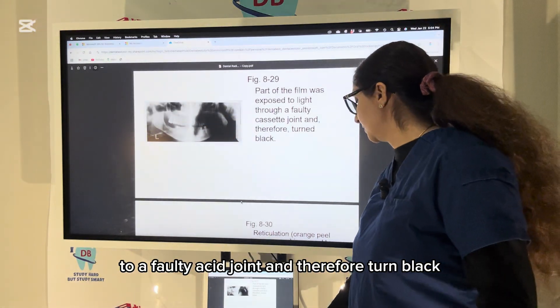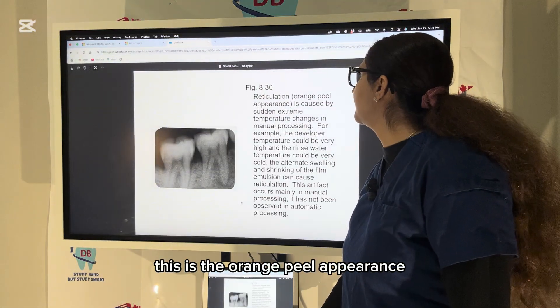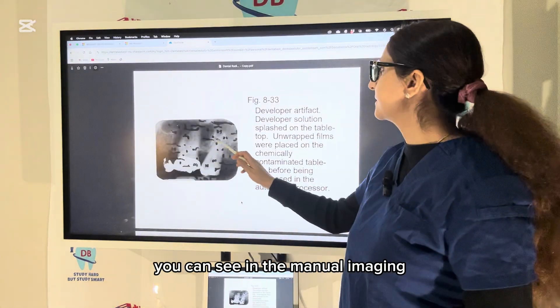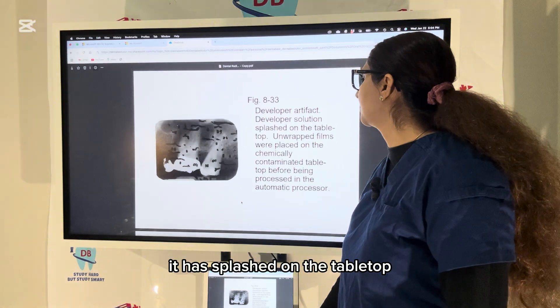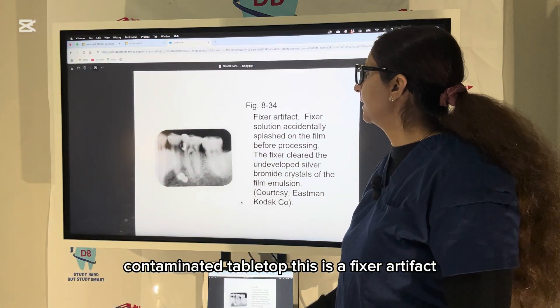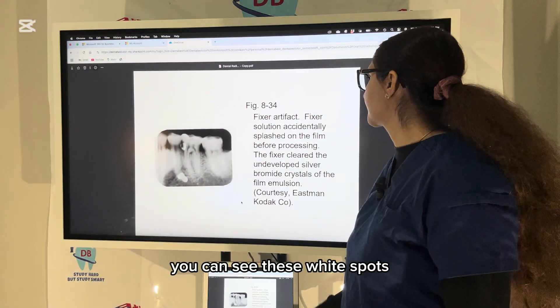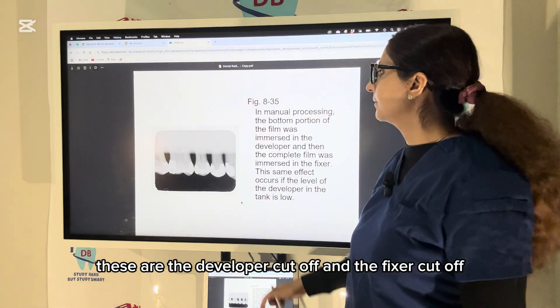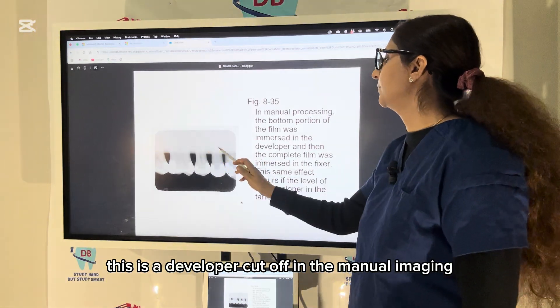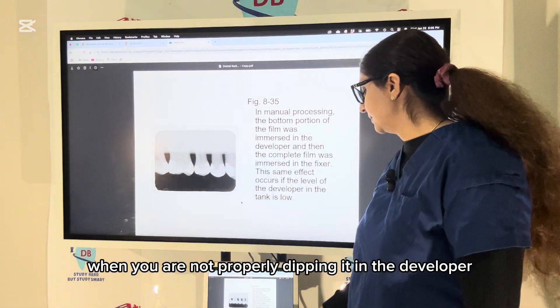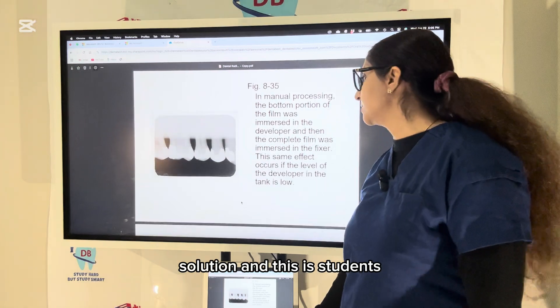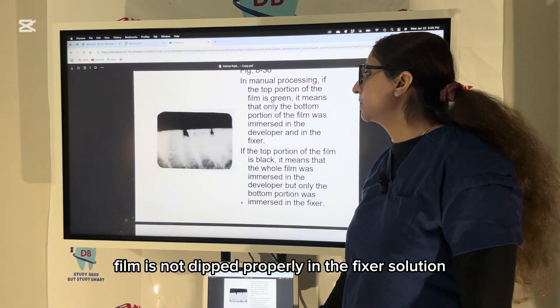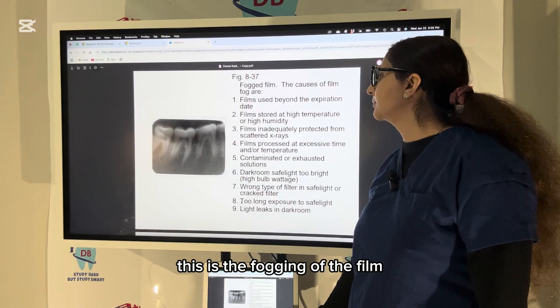This is the orange-peel appearance, caused by sudden extreme changes in temperature. Developer artifacts can be seen in manual imaging — chemicals splashed on the tabletop lead to a contaminated tabletop artifact. Fixer artifacts appear as white spots, which clear the undeveloped silver bromide crystals of the film emulsion. Developer cutoff occurs in manual imaging when the film is not properly dipped in the developer solution; fixer cutoff occurs when the film is not dipped properly in the fixer solution.